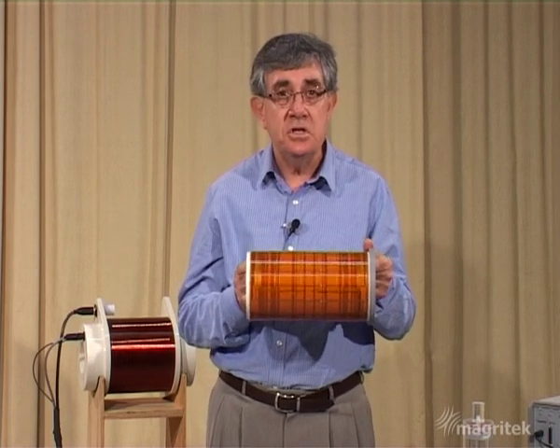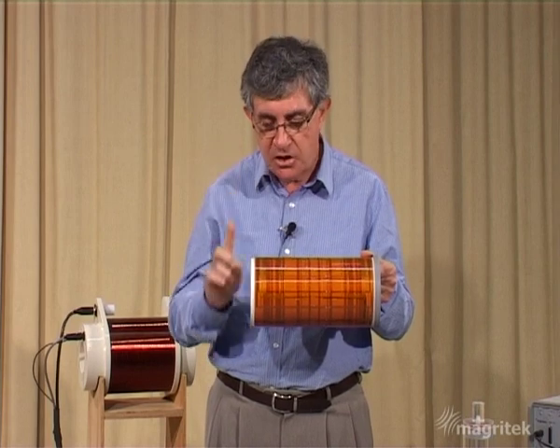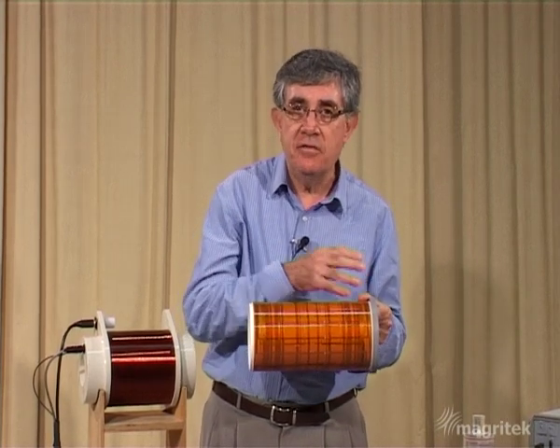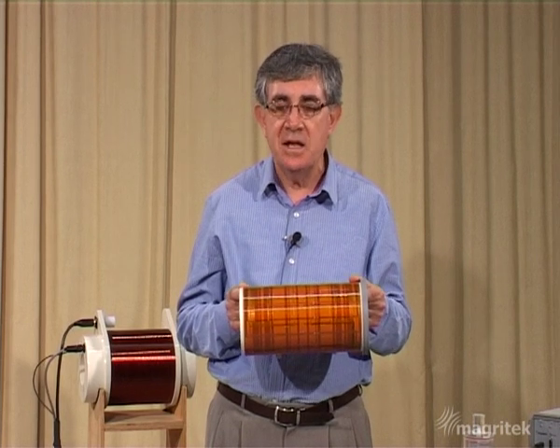So the idea is to use these gradient coils to produce the variation of magnetic field along the Z axis in combination with a spin echo experiment. We will see the spins come into phase and then back out of phase again under the influence of that magnetic field gradient.